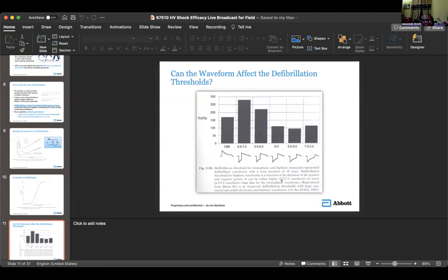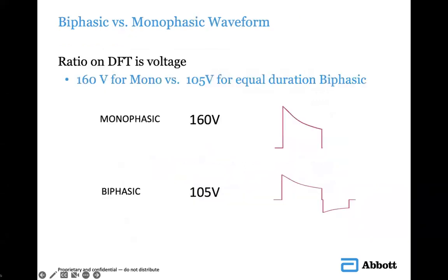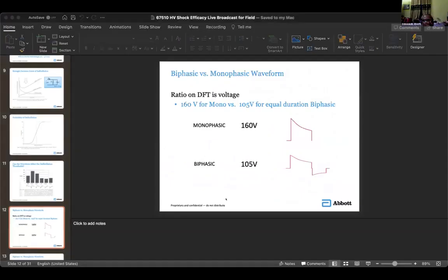Yes, I agree with you. No issue. All manual defibrillators have all that: the pacing mode, the defibrillator. It depends on the manufacturer, whether it's Philips, Biotronik, what have you, all of them have it. Only that we prefer biphasic to monophasic. Yes, correct.